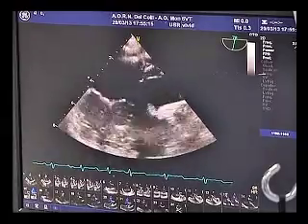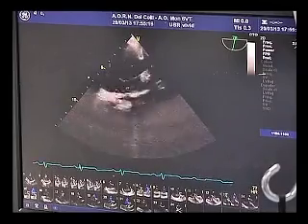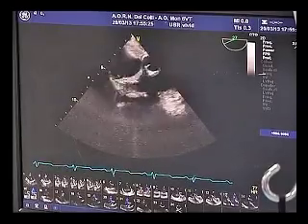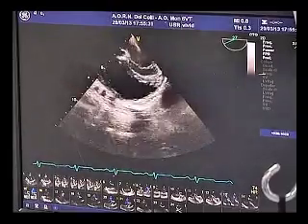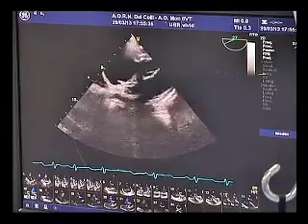Do you think that the first one was not allowing the second one to be positioned? Was one pushing against the other? Yes, I think we have to reprobe the first, the small one, and reposition a second device. It may be larger than this one.